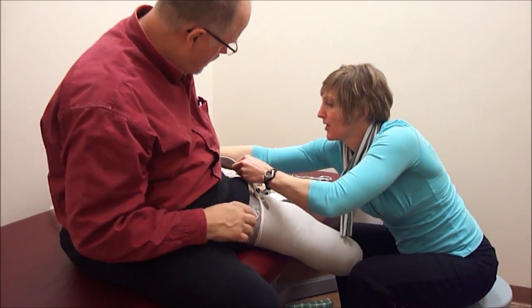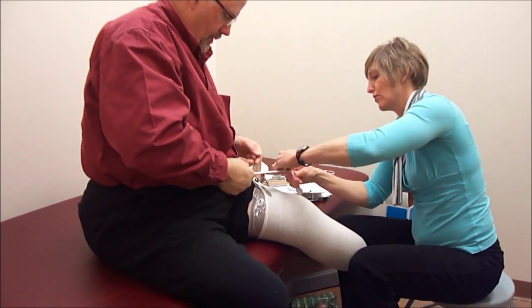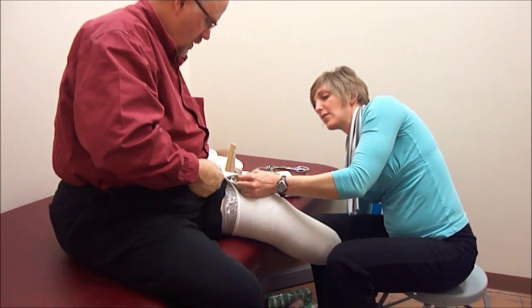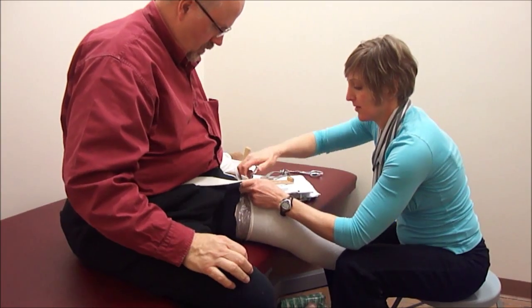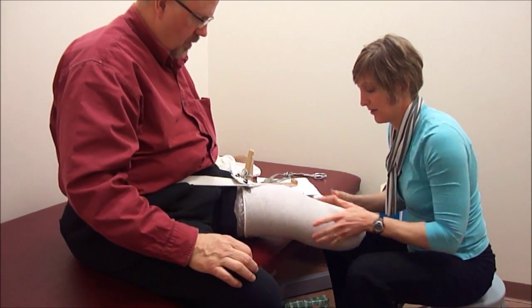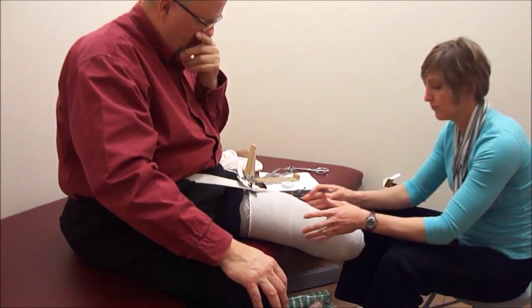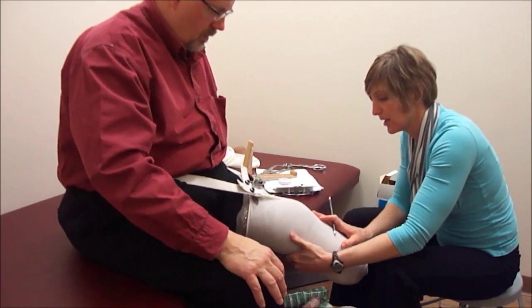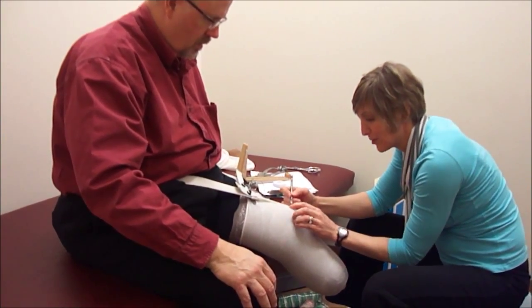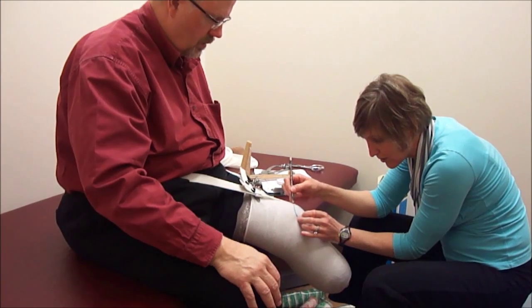I'm going to have you go ahead and bring that all the way behind you. Good. Is that too tight around your back? No, that'll be fine. You can go ahead and let go of that. Let that relax some. There you go. Good. I'm going to have you bend your knee just a little bit. It helps that kneecap to really pop open. And when I take the mold, I'm going to have you keep your knee slightly bent too.